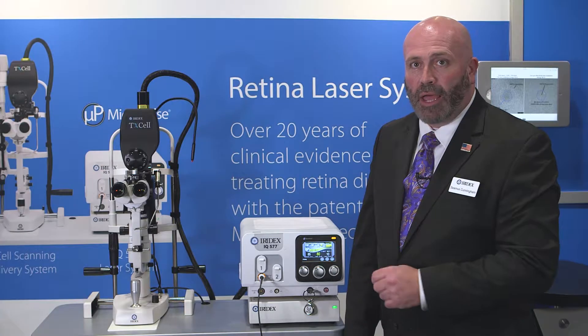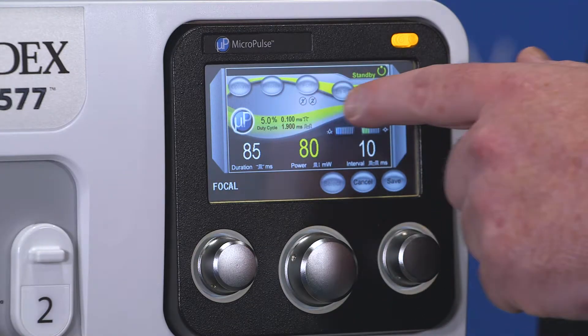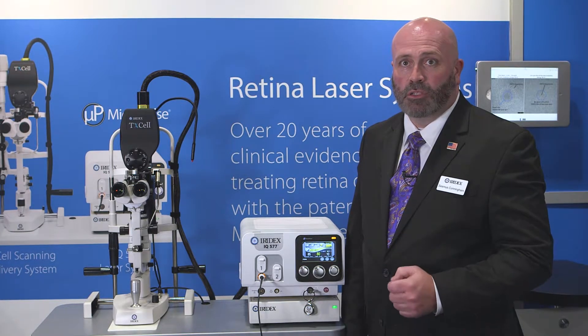As you can see now, the power setting has turned from white to yellow and there is a ribbon running through the center of the screen. On the IQ577, this will be a yellow ribbon. On the IQ532, this will be green. But both times, the power will be in yellow when MicroPulse is on and white when MicroPulse is off.